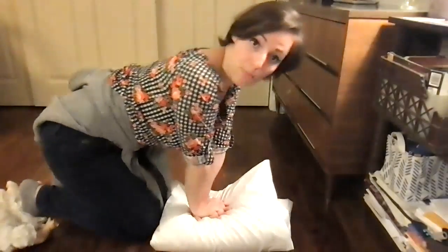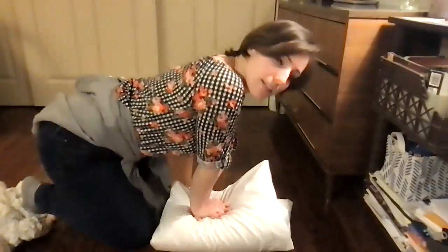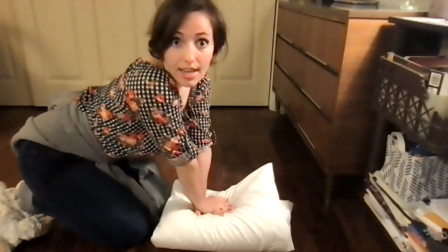We've talked about depth. Now we're going to talk about mechanics. One of the most important things is that you're getting good depth and that you're not tiring yourself out. This is exhausting work. I've done it, and it is tiring.